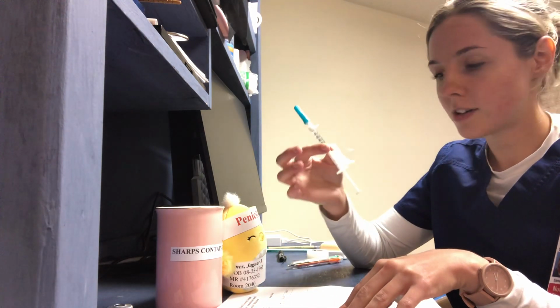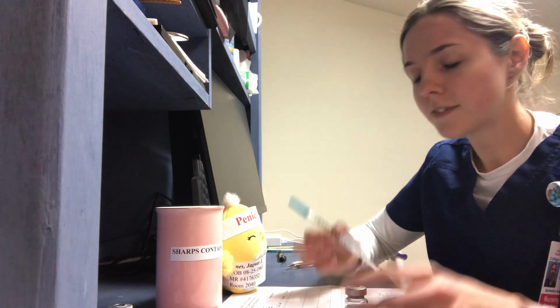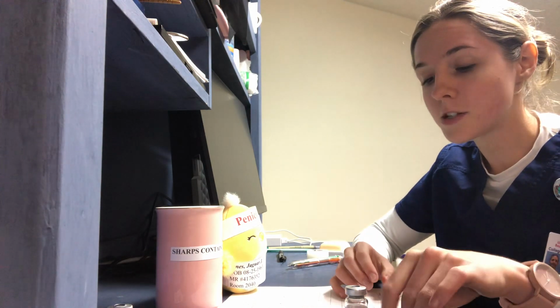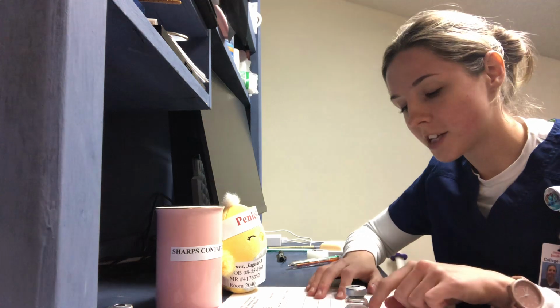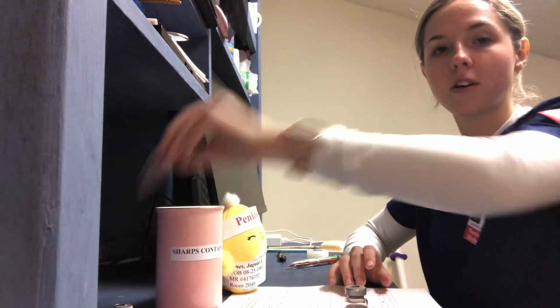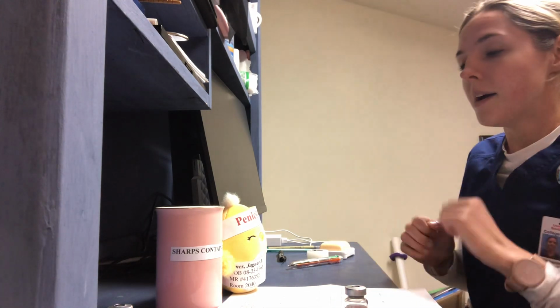Same for my needle, my syringe, I want to make sure that's labeled correctly too. So now that I've got everything good to go, I feel confident going into my patient room. I personally want to double check his allergies, penicillin, know that going into the room. So I'm going to get my alcohol prep pad because I know I need that going into the room. I'm going to knock. I'm going to enter.